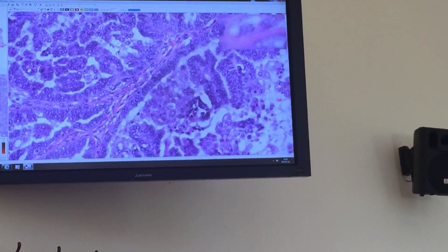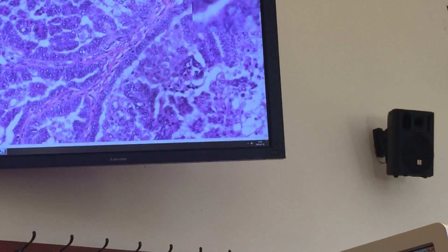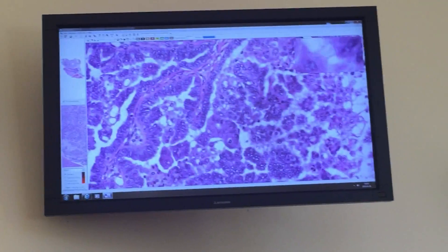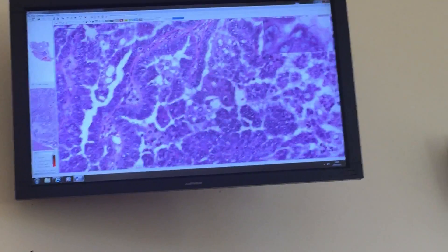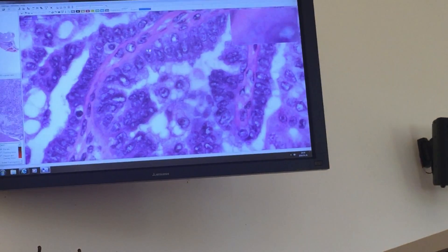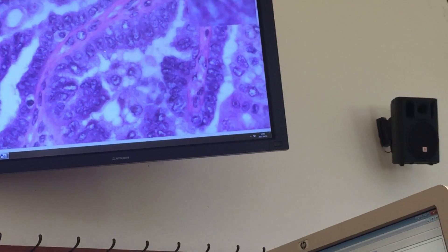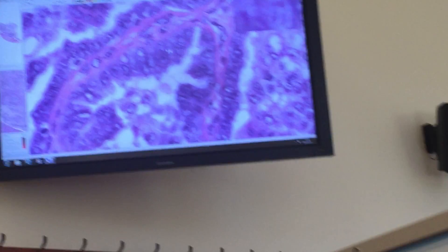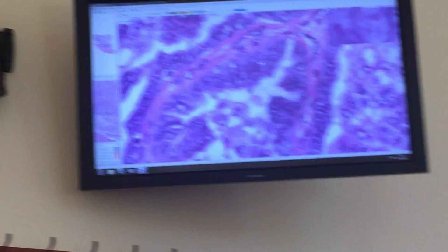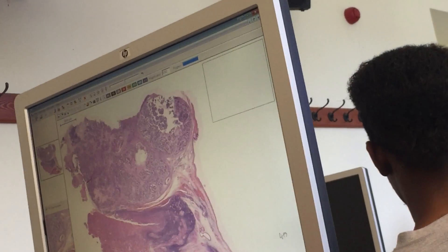You can see again it's a multiple layer, or like stratified type covering on the papillae. So usually again, columnar cells — you can see the cells are crowding, so like many cells in one line.